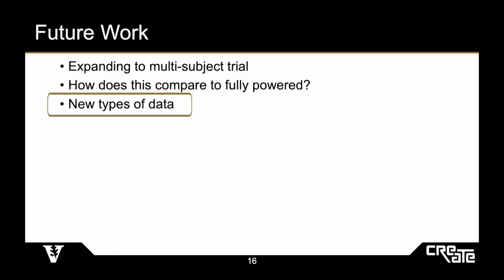Finally, we have developed a set of stairs with force instrumented handrails so that we can analyze the direction and magnitude of force a person is exerting with their arms. We hope this will provide us some insight in the previously mentioned trials as to whether the person is using handrails for left-right balance, vertical stabilization, or to offload the amount of work they would otherwise have to perform with their hip.